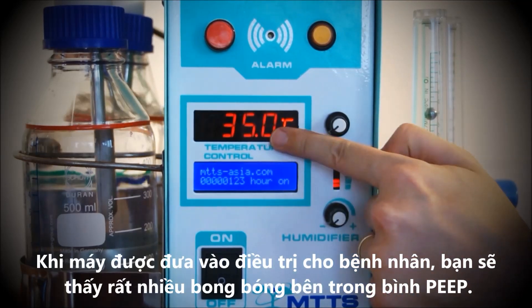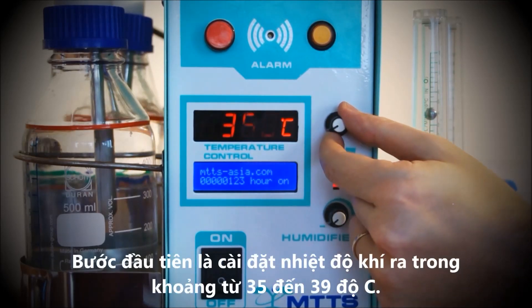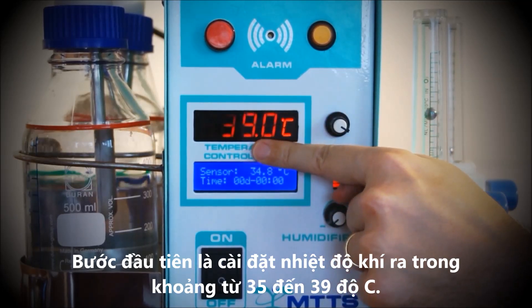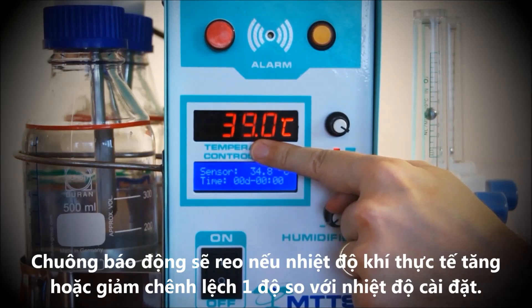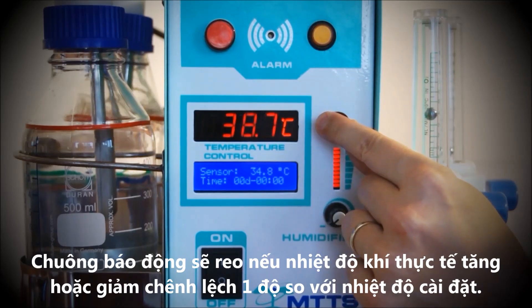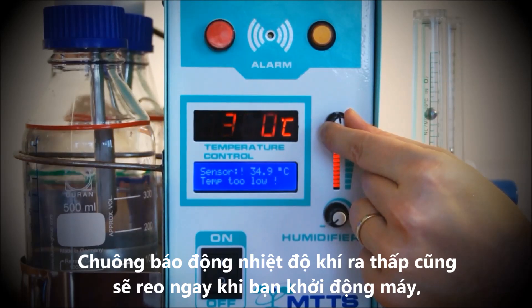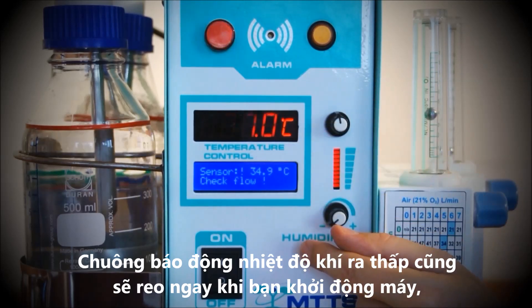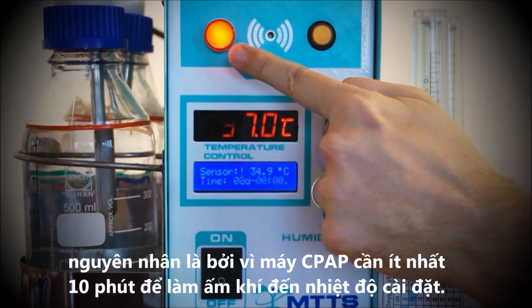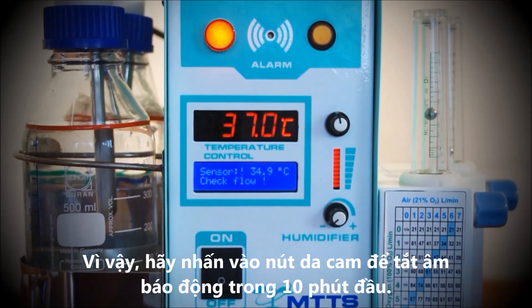Once the patient is connected, you will see bubbling in the PEEP bottle as well. The first step is to set the gas temperature, which can be set from 35 to 39 degrees Celsius. An alarm will sound if the actual temperature drops or increases by 1 degree below or above the set point. An alarm indicating low gas temperature will also sound when you turn on the device, because the CPAP machine takes about 10 minutes to reach the desired gas temperature. The alarm can be muted for 10 minutes by pressing the orange mute button.